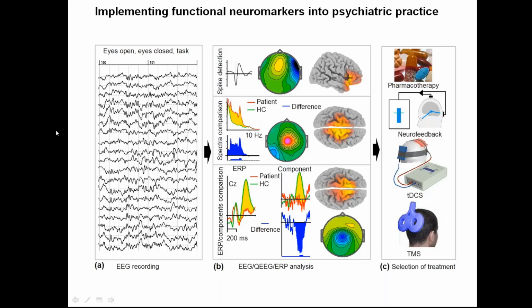Using this new methodology, we can easily correct eye movement artifact, but other types of artifact, like movement of the head, cannot be properly corrected. So a good recording of EEG is critical. Okay, so you record EEG.